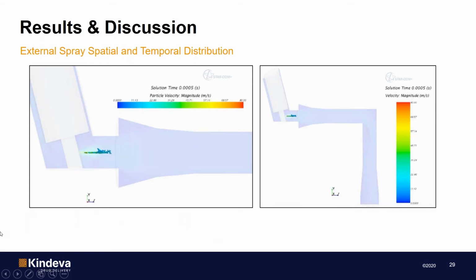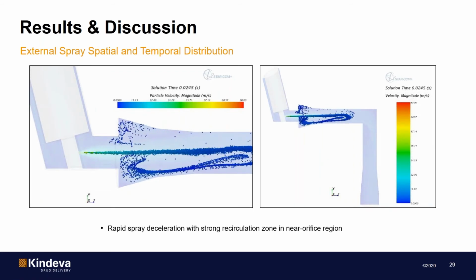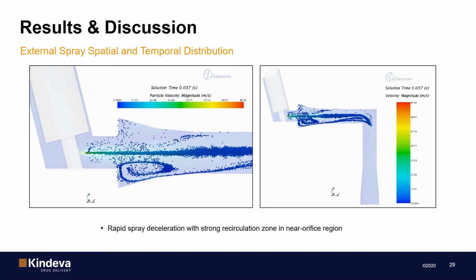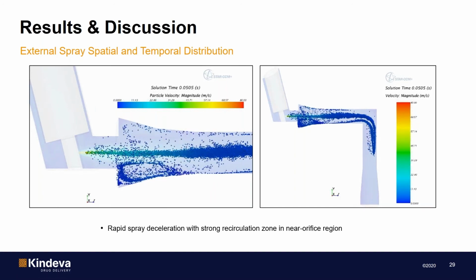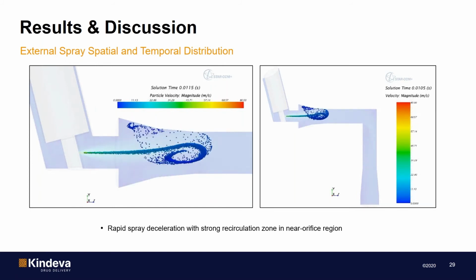Right. So now here we show an animation of the spray dynamics inside the induction port, and the color code here basically corresponds to velocity magnitude. We can see the spray is emitted. As you can see, the spray is emitted with a very high velocity, and if I can just pause this. Yep, starting from the beginning.